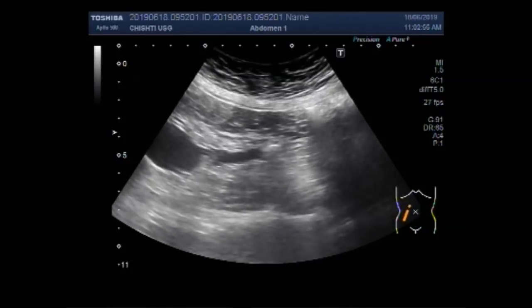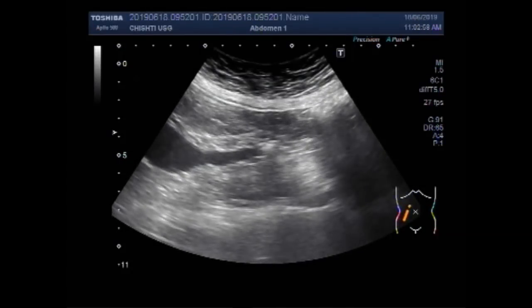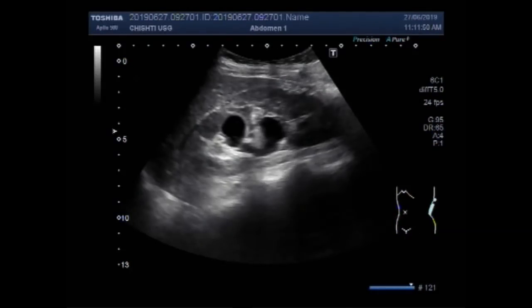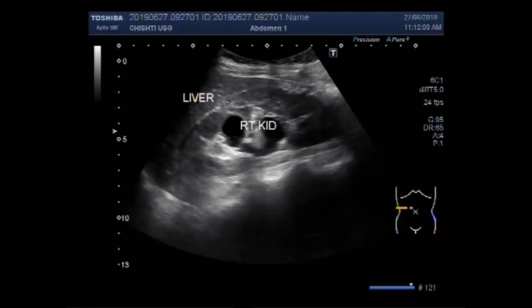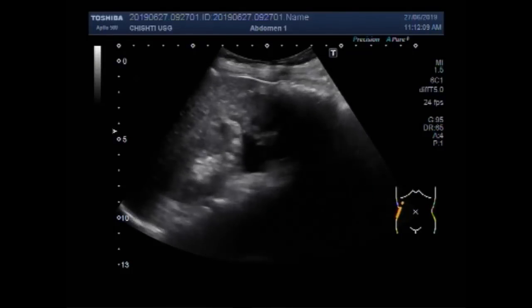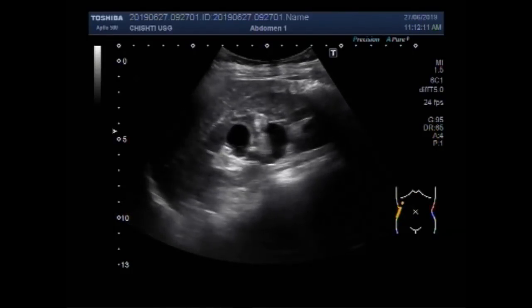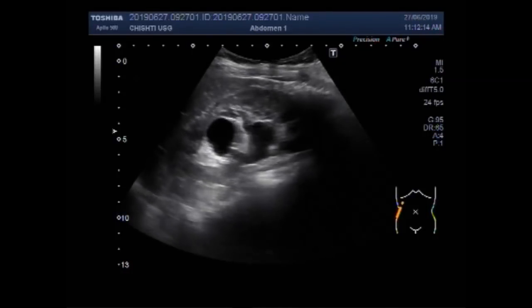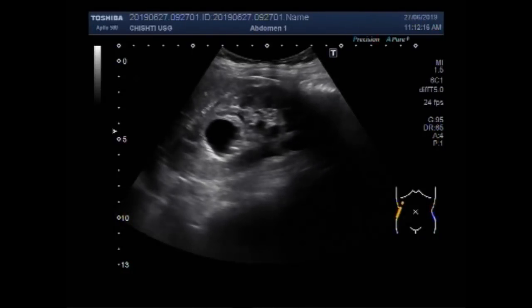Again you can see the stone shadowing. This stone is visible in the upper one-third of the right ureter. Now you can see another case — another case of stone in the right ureter. In this case the stone is of minimum size; there is a very small stone seen in the distal portion of the right ureter.